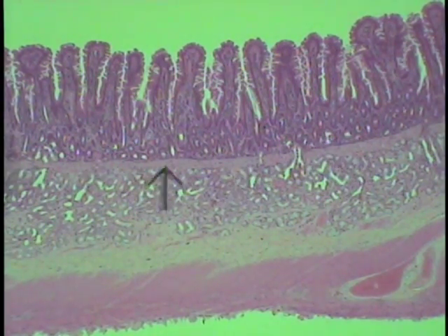Secondly, the glands within the submucosa, Brunner's glands, tell you immediately this should be a section through the duodenum, because Brunner's glands or the duodenal glands are the only glands in the submucosa within the gastrointestinal tract.